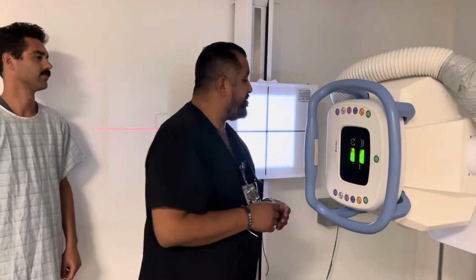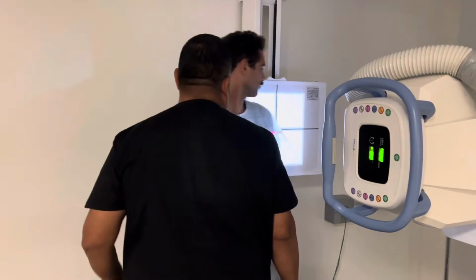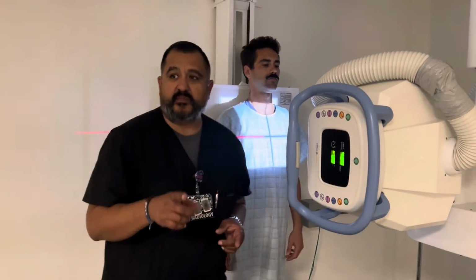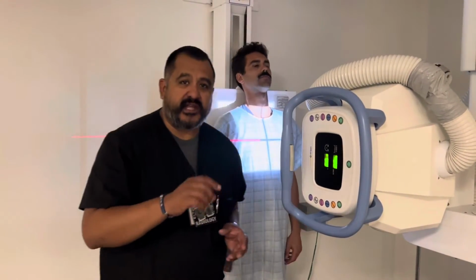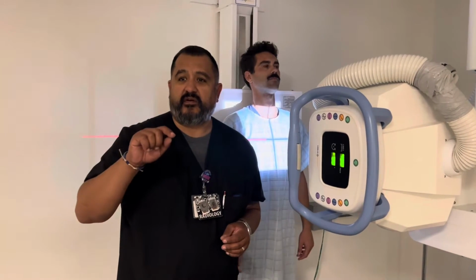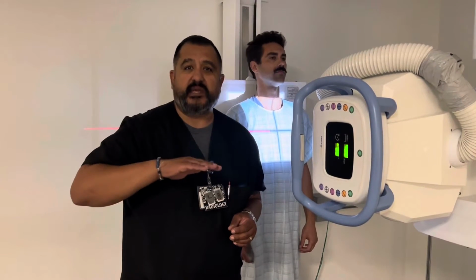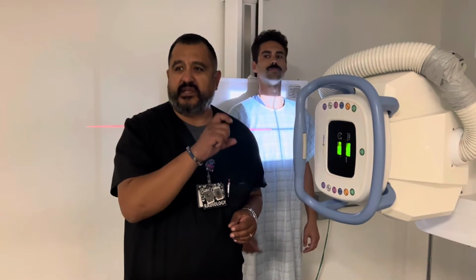What we're going to have our patient do is put their back against the board right over here. We're doing upper ribs, which is above the diaphragm. On your technique charts, it might say AD for above diaphragm. If you're doing ribs below the diaphragm, it'll say BD, if you ever look at the technique charts.